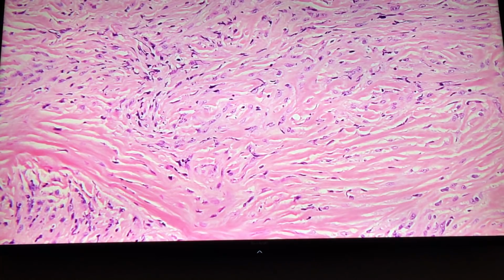Yes, the other stuff is unlikely to be positive in this. The mesothelial markers are extremely unlikely to be positive. So what you would want, if you only had this, is you would want to see invasion into the chest wall or fat. You want to see keratin positivity diffusely through this thing, and you want the classic clinical features.